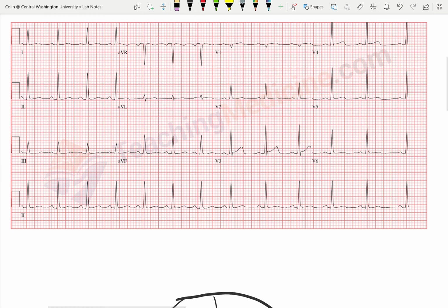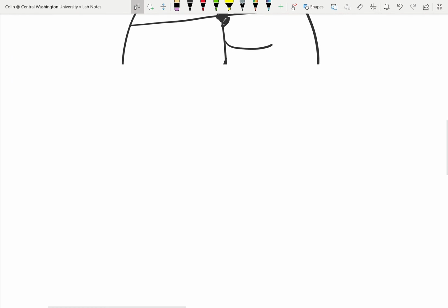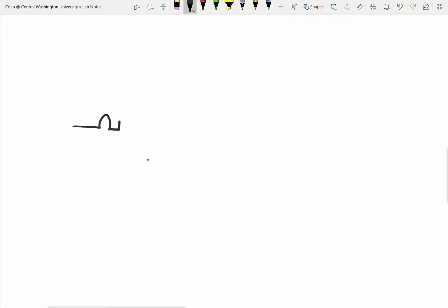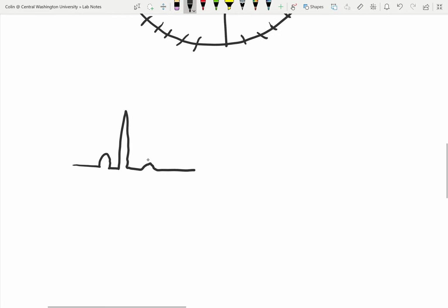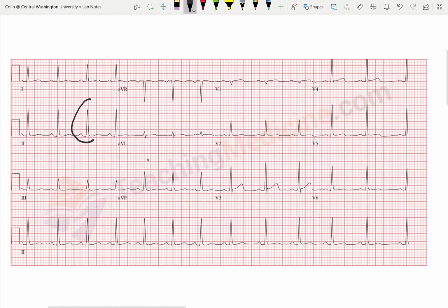So let's get started. Scroll down here, go past our heart. So okay, why is it called the QRS complex, right? So this is what we've been drawing the whole time. P wave, QRS, T. So then there's our normal heartbeat that we've been looking at, and it should look very similar to everything up here, right? There's P, QRS, T.